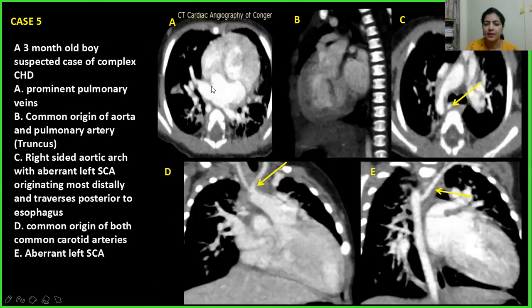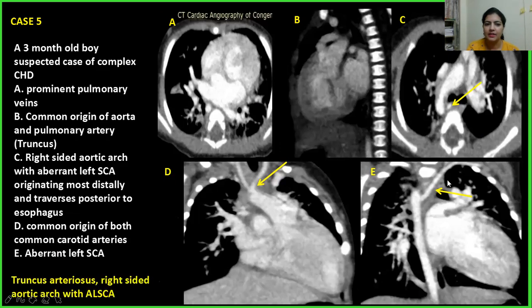Case 5: Prominent pulmonary veins were noted. There was a common origin of the aorta and pulmonary artery — truncus. A right-sided aortic arch with aberrant left subclavian artery was seen, traversing behind the esophagus, with common origin of both carotid arteries and the aberrant left subclavian artery. This was a case of truncus arteriosus with right-sided aortic arch with aberrant left subclavian artery.